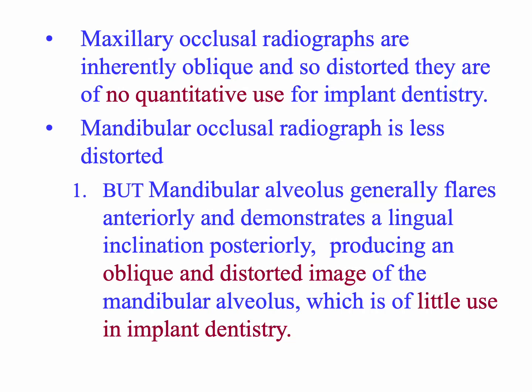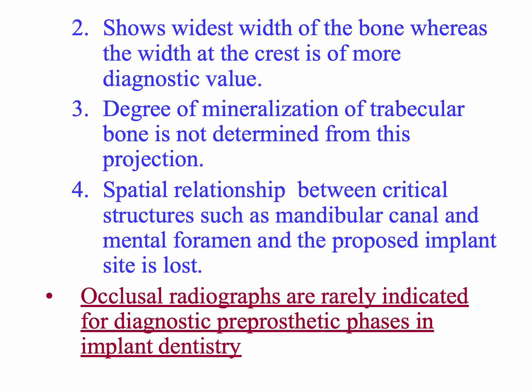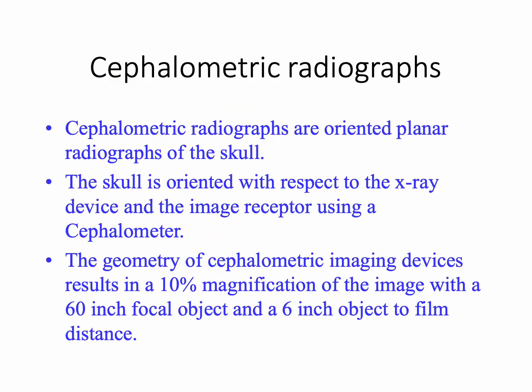Mandibular occlusal radiographs seem to be less distorted, but it should be remembered that there can be oblique or distorted images, and it is of limited use in implant dentistry. Occlusal radiographs are rarely indicated for diagnostic pre-prosthetic phases in implant dentistry because they do not determine any spatial relationship with the associated anatomical structures.